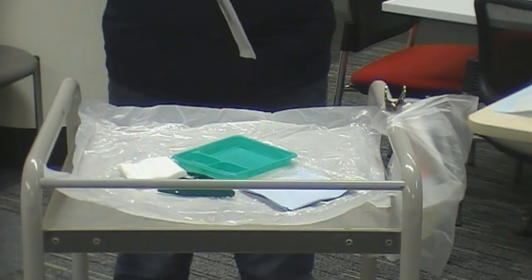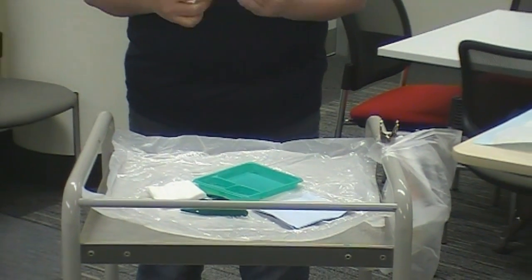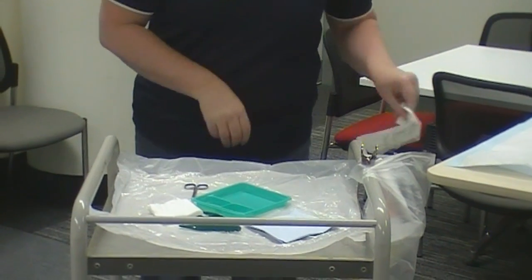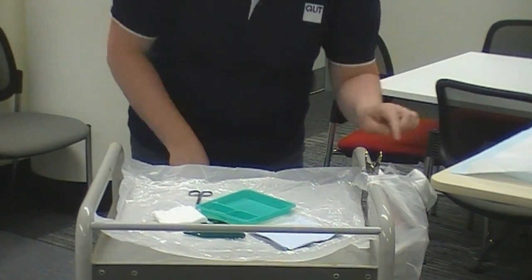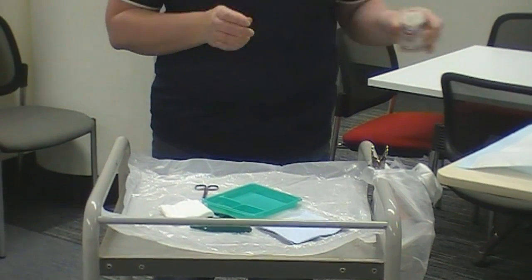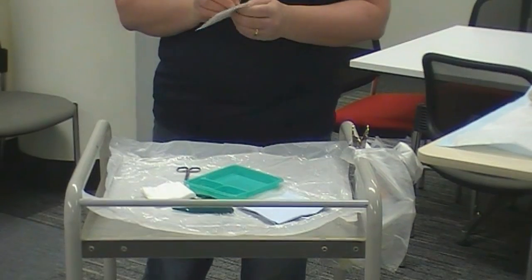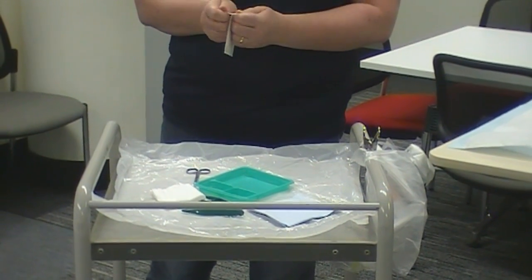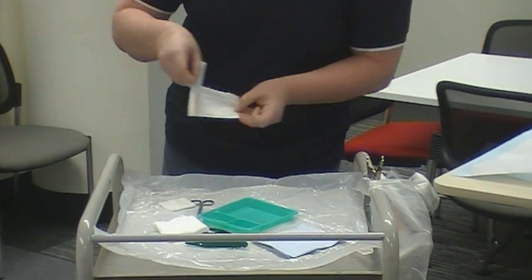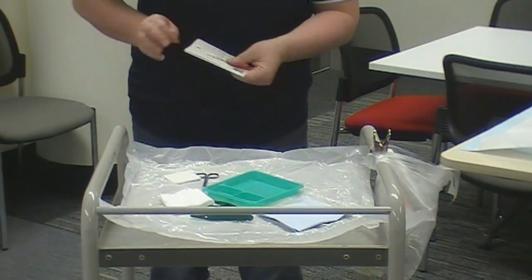The order for what you put on next doesn't really matter — however you grab it is usually how I go. My bandage I'll actually open but I'm going to put next to the patient so that it's handy when I'm at that point. Always open away from your field, so nothing goes over the field from your packaging.